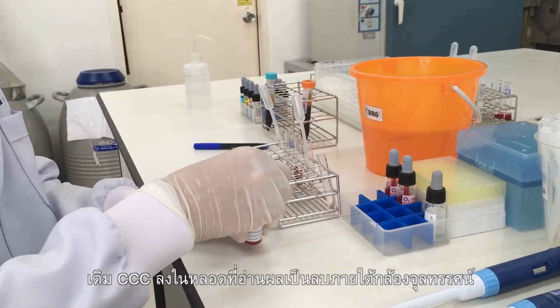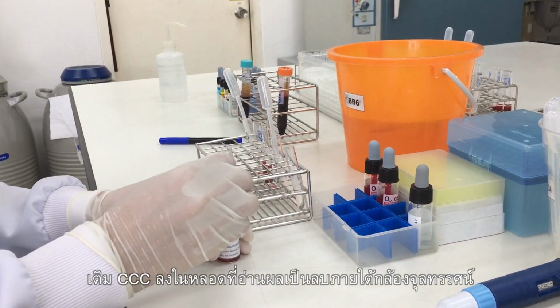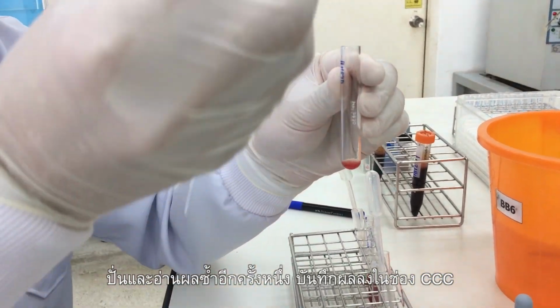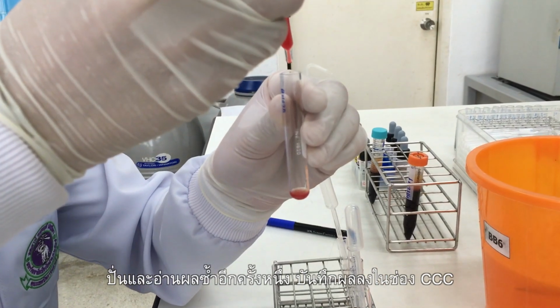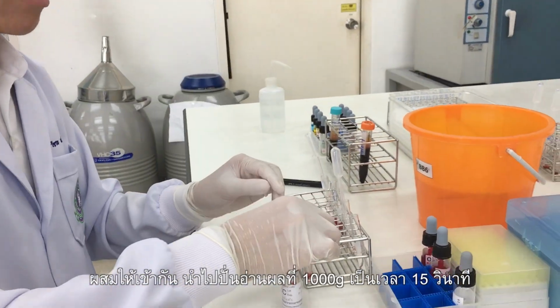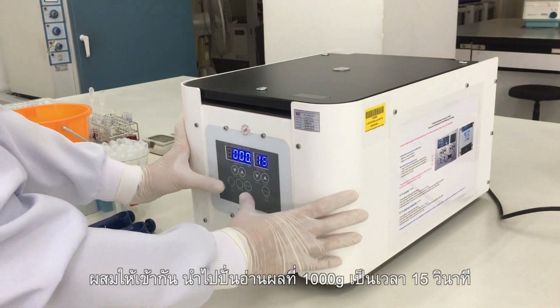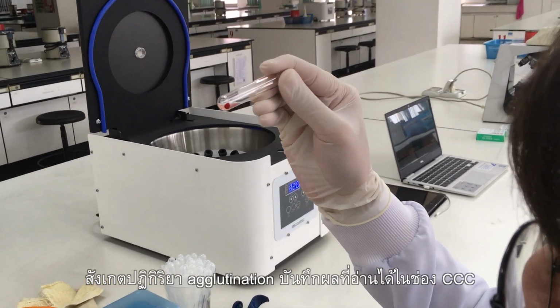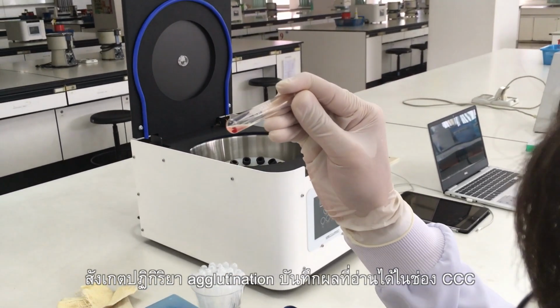If there is no agglutination observed under the microscope, transfer 1 drop of IgG sensitized red blood cells or Coombs control cells. Mix and centrifuge at 1000 G for 15 seconds. Observe agglutination, grade the reaction and record in the CCC phase.